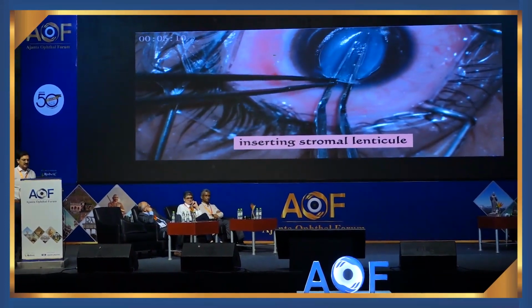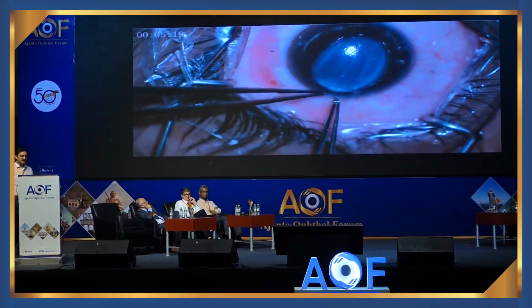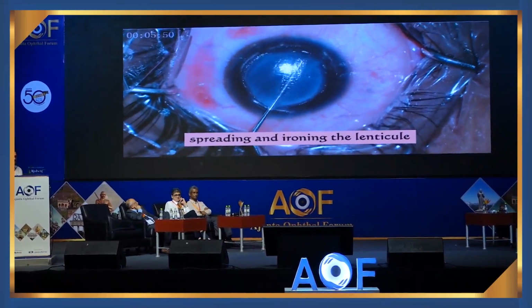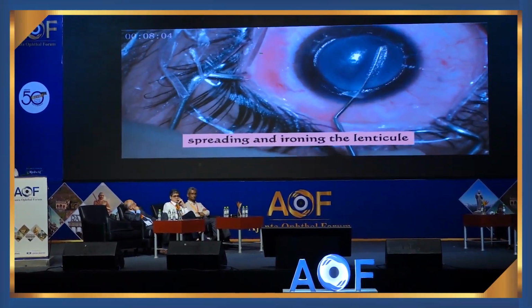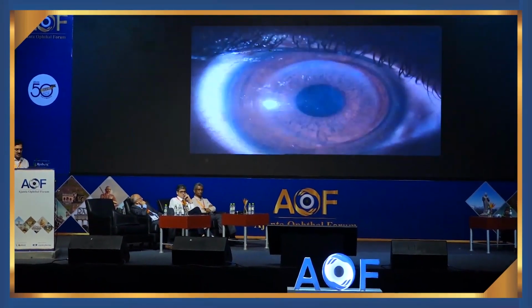Then the implant is inserted into the cornea, into the center. This works well in selected cases of central cone, not in the peripheral cone, which we commonly see in India. Inferior cones, it's not a very good technique. Central cones, we tried for many years. We started almost 15 years back, and tried a few cases.